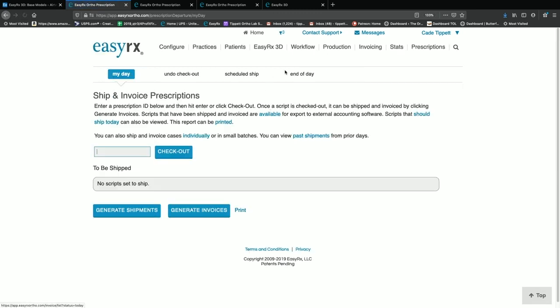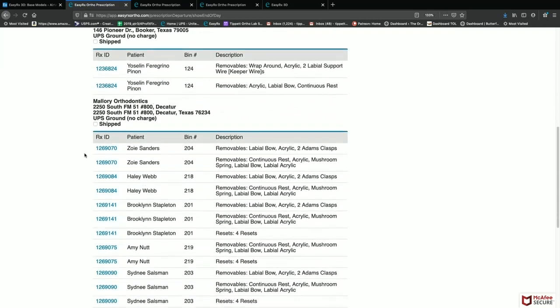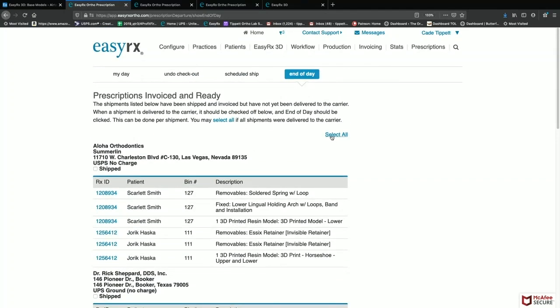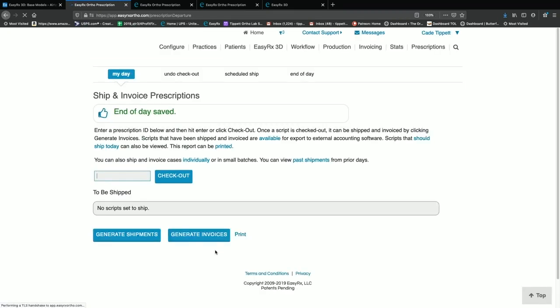Now, when you're done with the day, you go to end of day. And I left this up. So these are all the things we shipped out Friday. And I can go back and view each one if I want to. But once I select all and do end of day, it goes to each one of those and says completed, or shipped, so the doctor can see that it has been shipped.